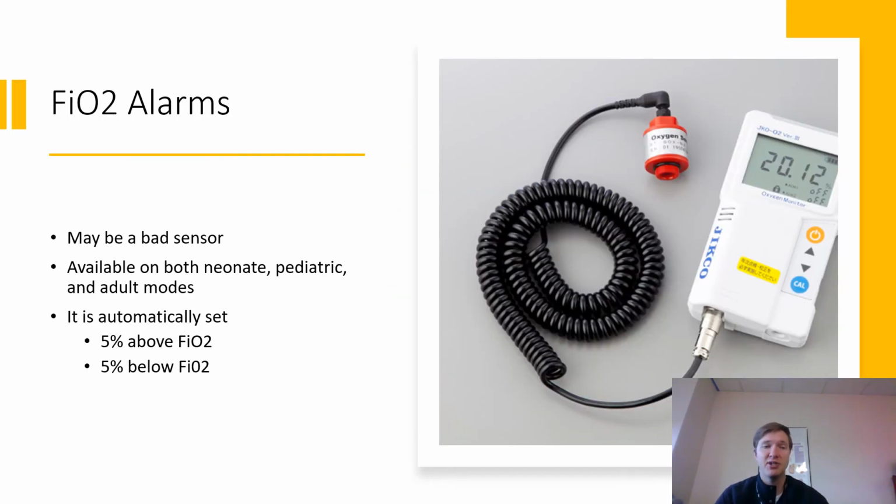All right, FiO2 alarms. This is the last slide that we'll talk about here. This is obviously an oxygen sensor. So when we're looking at this, it could be a bad sensor. I've seen a couple of these in my practice for sure. And these are easily switched out even when a patient's on a ventilator. It just depends on the manufacturer and what the biomed personnel recommends. But it might be just a bad sensor that needs to be switched out. It's obviously not life-threatening. It's just a sensor that needs either recalibration or changing out.